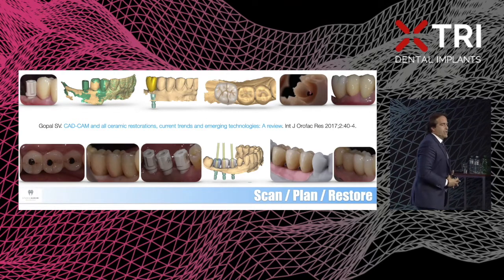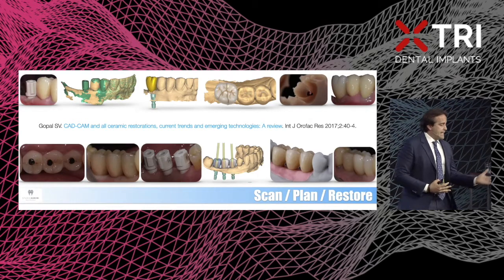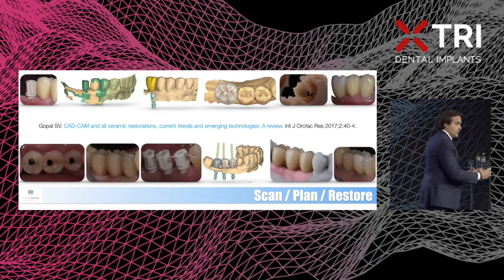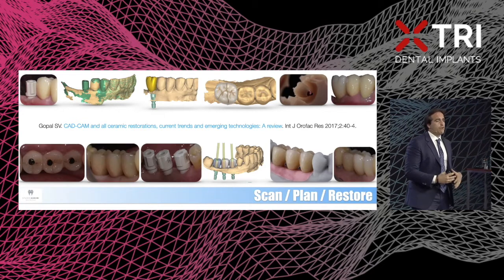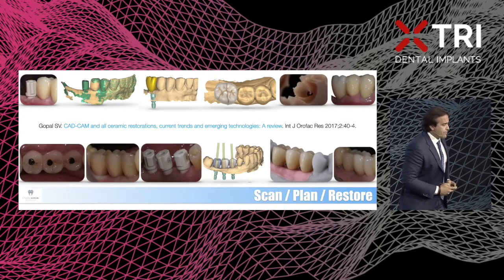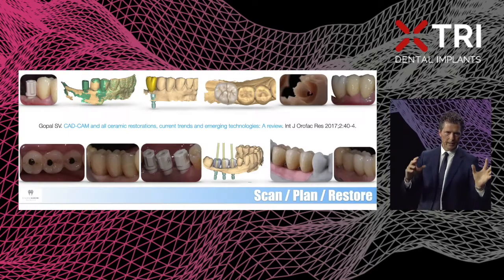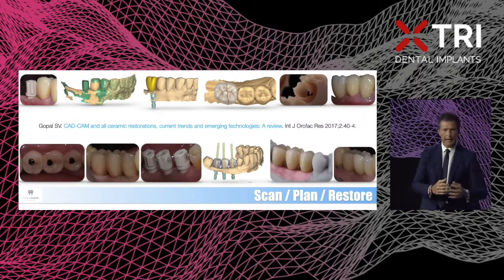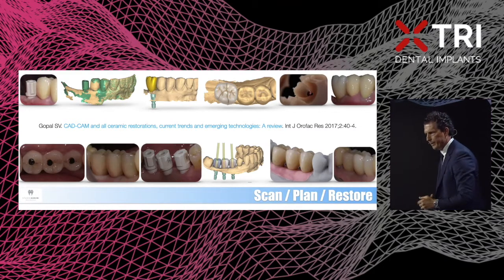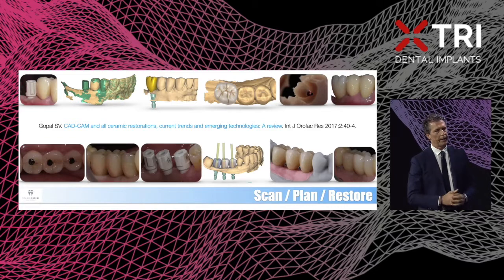Until today, we were able to scan, to plan and to restore and to close cases such as this in one single appointment, combining technologies, monolithic materials, and of course, the dental team and the dental lab know-how. So we have the CAD/CAM technologies inside, we have the acquired data, then the data elaboration by the CAD/CAM lab technician, and then the production phase.